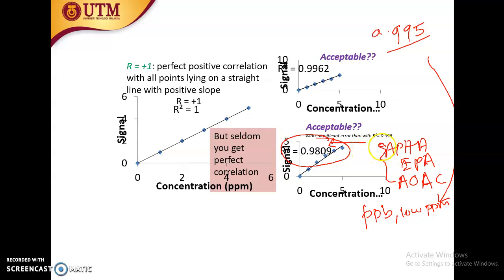If you refer to this method, based on APHA method, EPA method, it stated that if the analysis is done in trace levels such as ppb, it is acceptable worldwide. Then your data and your evidence, everything may be accepted in court. You will learn how to defend all your data with Dr. Najib or Dr. Afiq later.